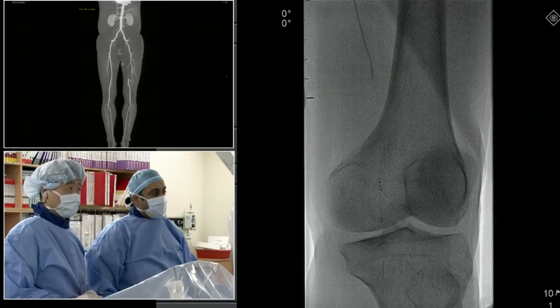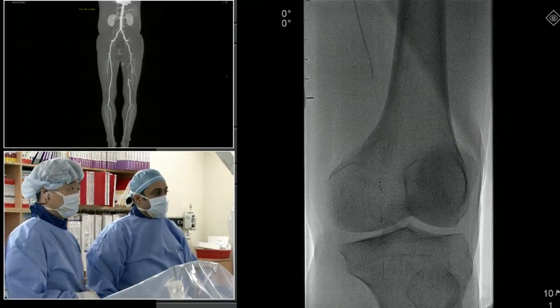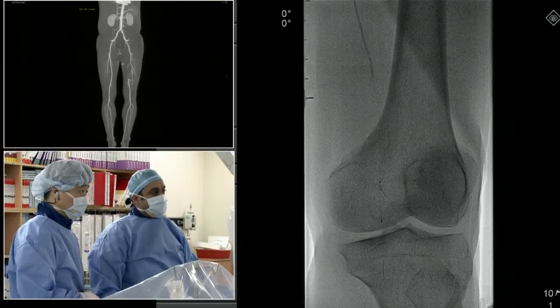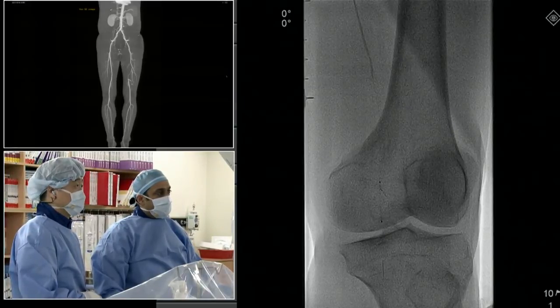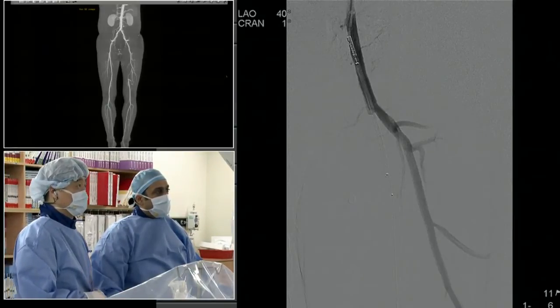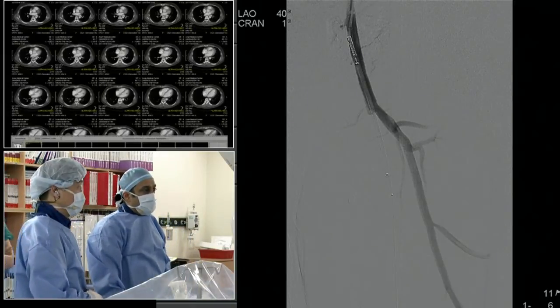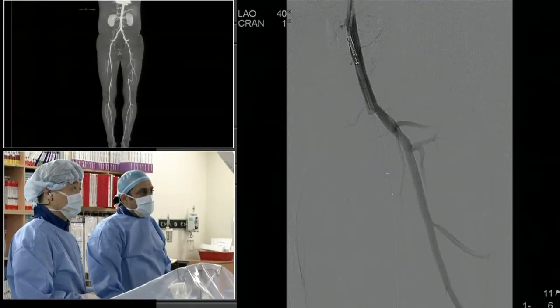My concern was with the large amount of plaque. Unclear if there's going to be any thrombus in there since I don't know the patient, don't know the length of his symptoms. I decided to just have some insurance, put a filter in there. That's a 6-millimeter Spider. Really, anything with an 014 wire would work. And then we started with a Silverhawk LXM device. This is the one with the long nose cone, hopefully minimizing the number of passes I have to do.